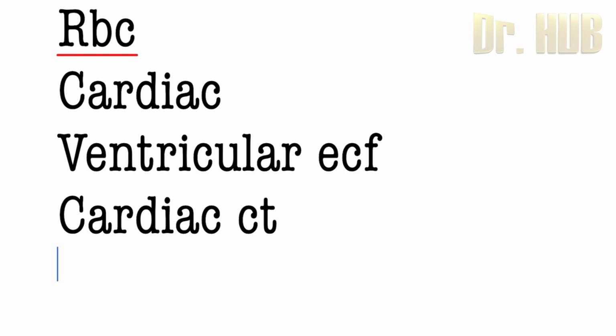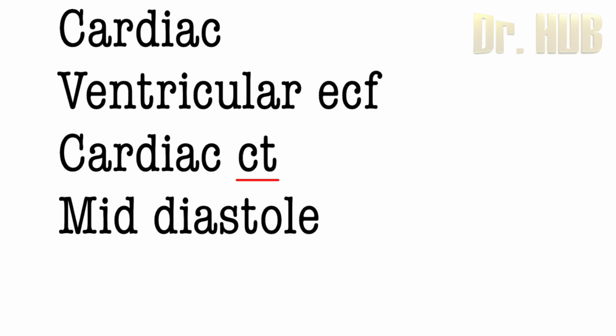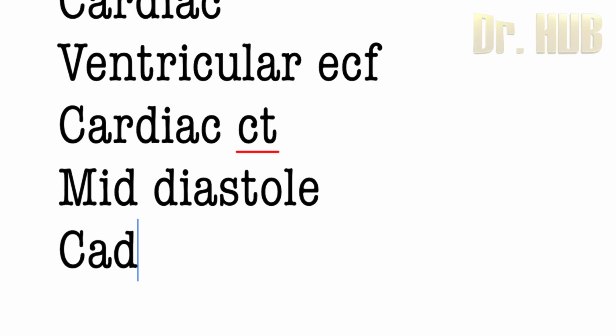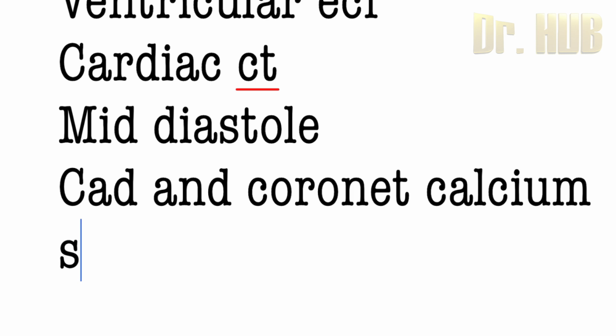The cardiac CT is done in mid diastole. It is done in CAD and also for coronary calcium scoring.